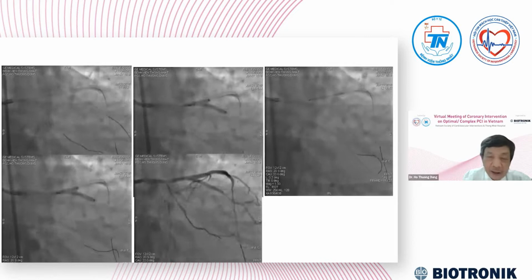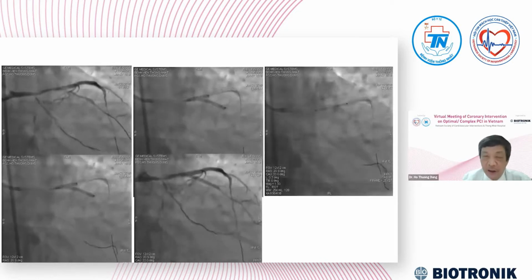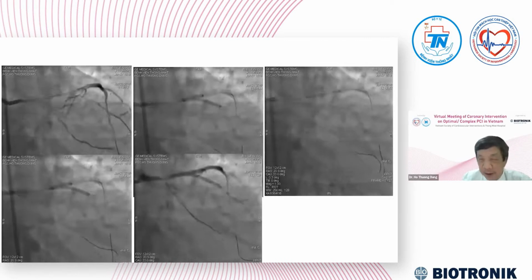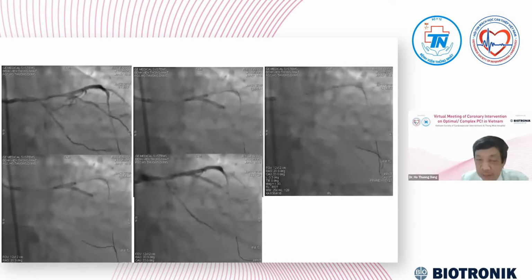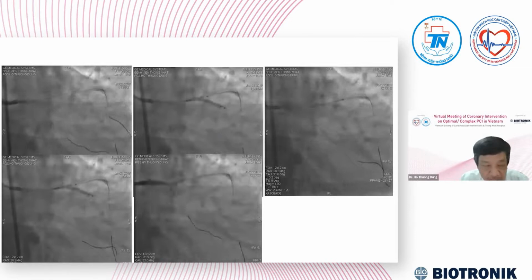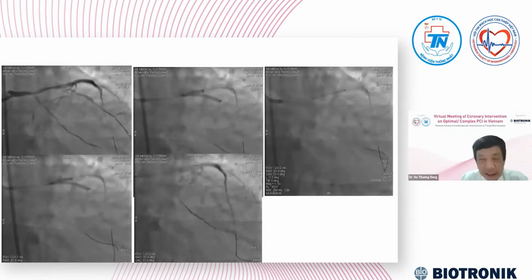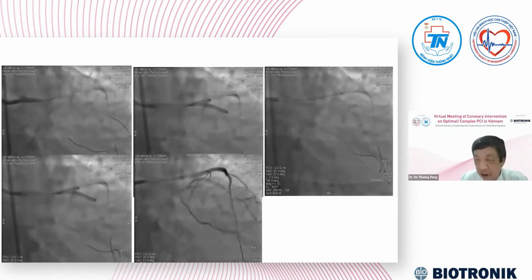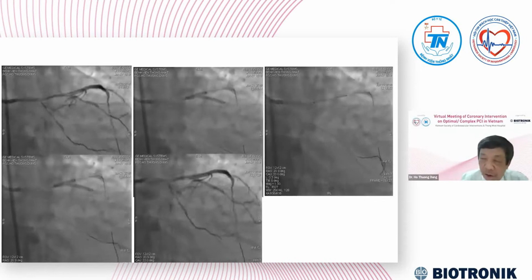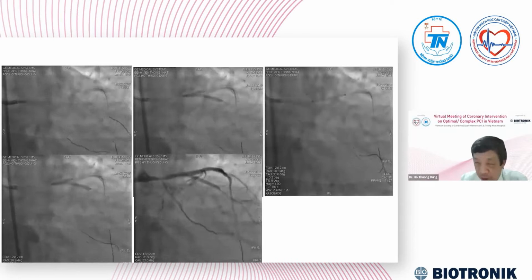You can see here in this picture, we already performed two stents in the LAD when we did the estimation, because we didn't have the exact diameter. We had intravascular imaging, OCT. But the OCT in this case could not give me more information, because as you know, to record a clear image we must flush blood out of the vessel.